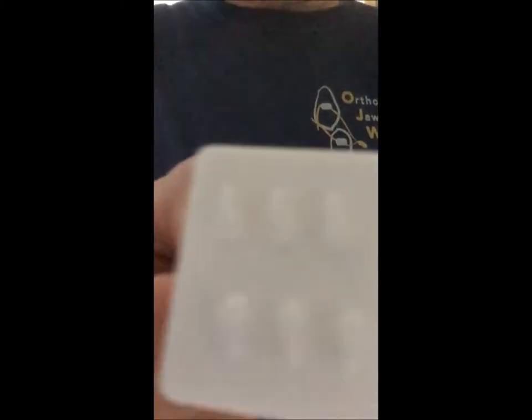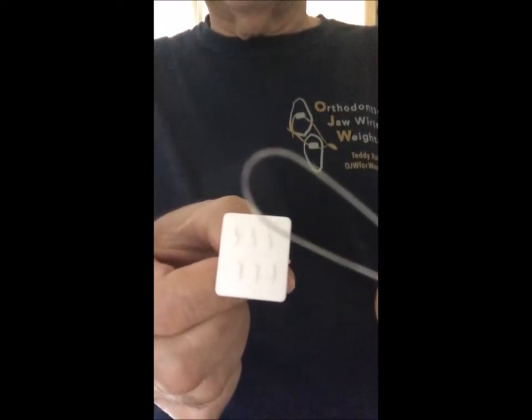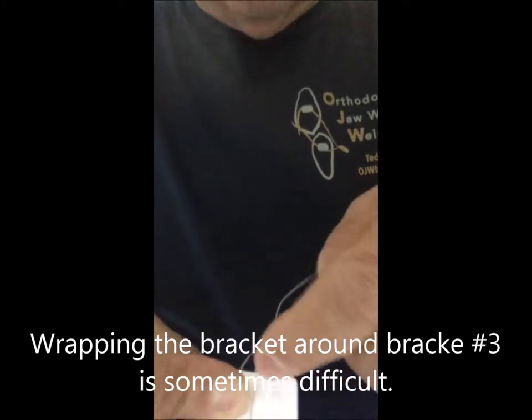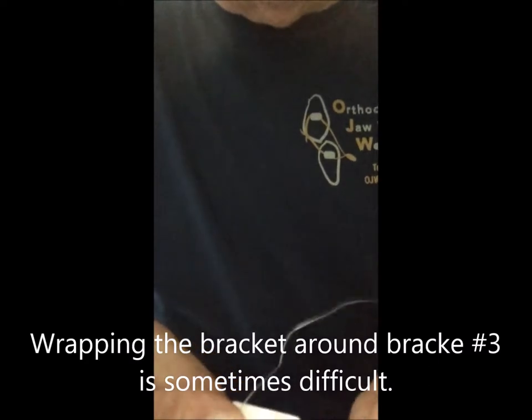The patient begins the practice with a 9-inch piece of wire folded in half. They would place the wire around bracket number one and hold it there. Take the top half of the wire and move it out of the way. Then they would wrap the wire around bracket number two, up around bracket number three, down around to bracket number six.